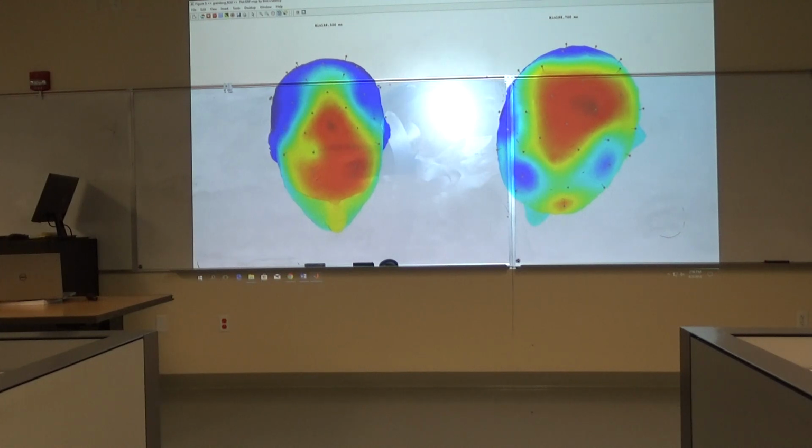They changed the mean count to reduce just the first one. I click one and then I just say, yeah, rename it. I just hit replace, yeah.